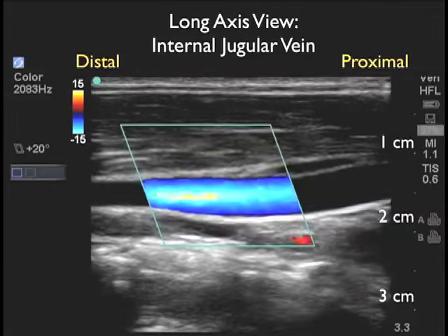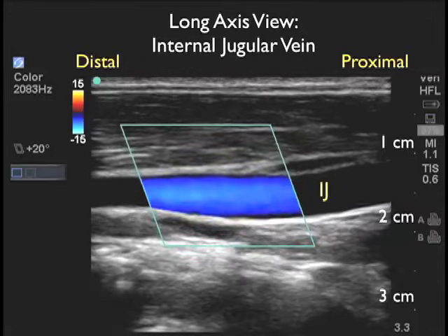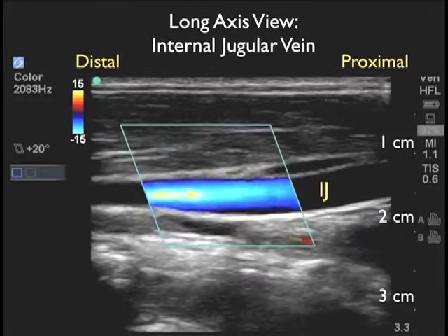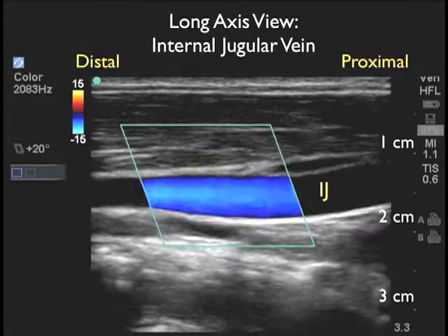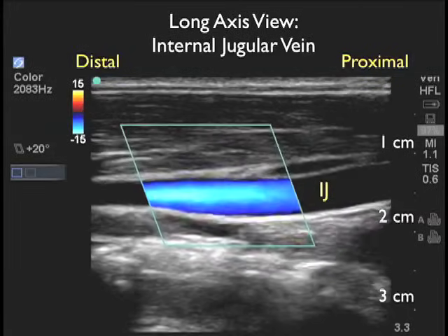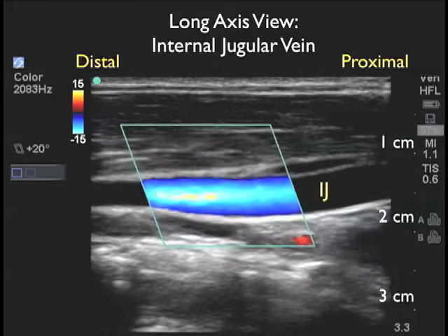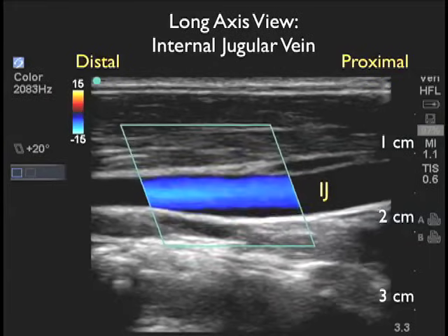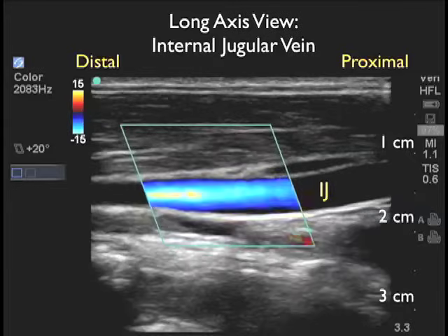Here's a long axis view of an internal jugular vein. I have the probe marker going more distally or superior within the neck, so to the left is distal and to the right is proximal. Notice the internal jugular vein that appears like a tubular structure on the ultrasound screen, and we see the blood flowing here from left to right.